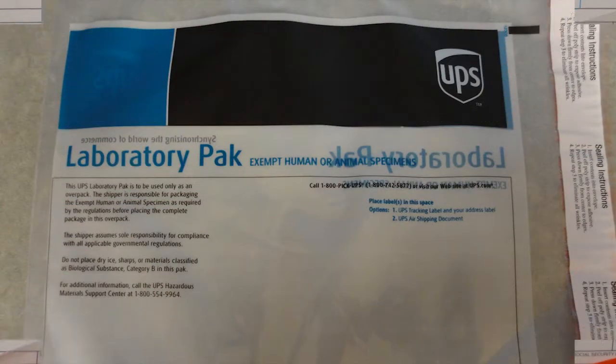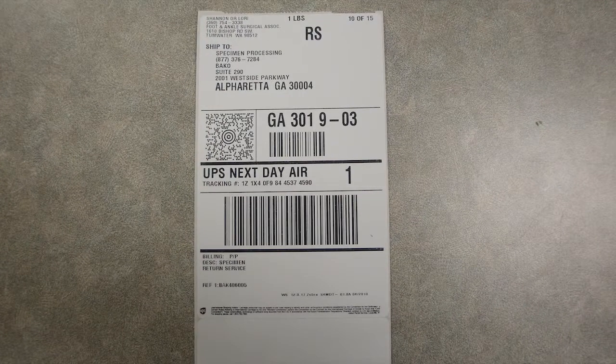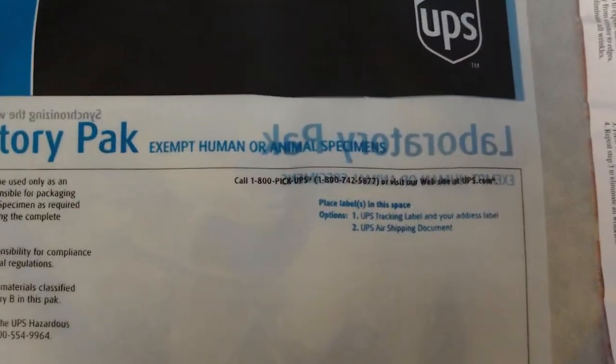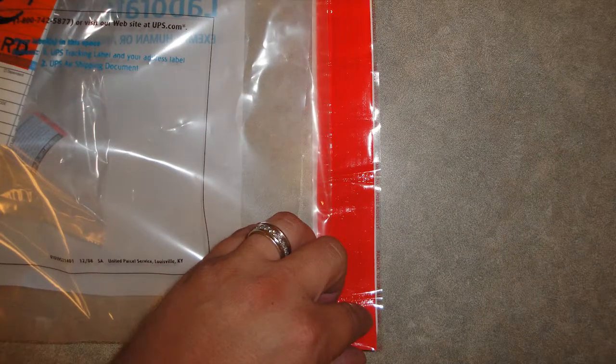You will then need a UPS laboratory pack and shipping label, which are located in the nurse's station with all the pathology supplies. The pre-printed shipping label is to be placed on the front of the laboratory pack in the spot that states "Place this label here." The biohazard package with the specimen, demographic sheet, and pathology orders will then be placed in the pack, and the pack is to be sealed by pulling the red material strip. This will uncover adhesive that can be turned over.